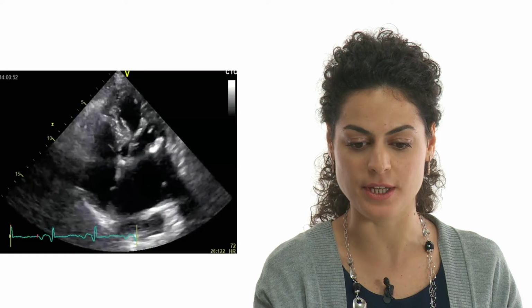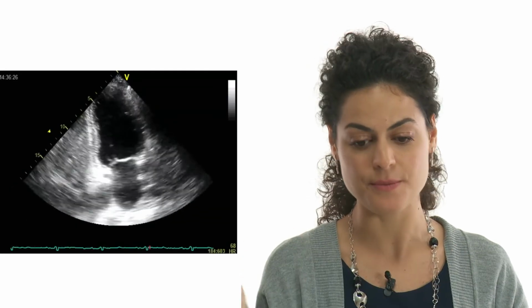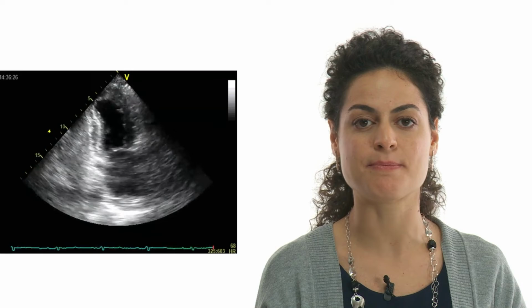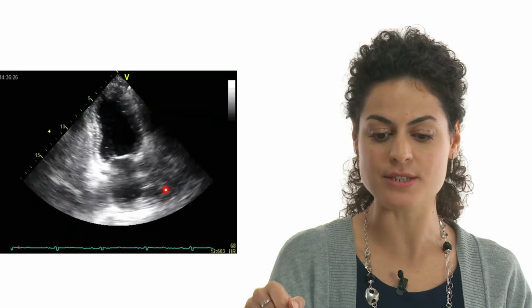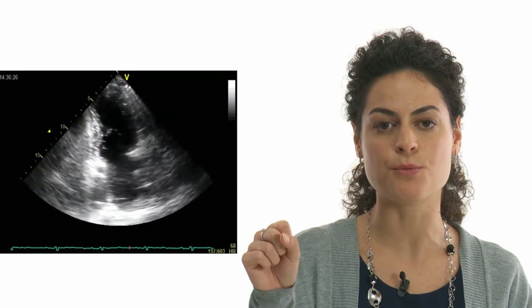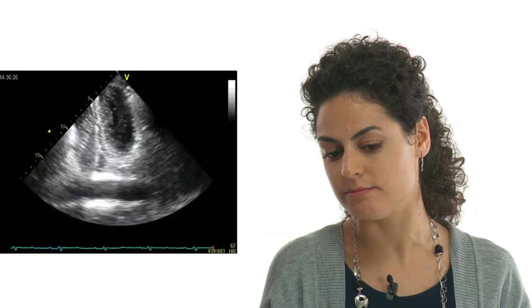And the same thing we can see, but in its length, in the 2-chamber view, just by tilting the probe more caudally. With this movement, we lose the left atrium, we look more posteriorly at the descending aorta in its major length.